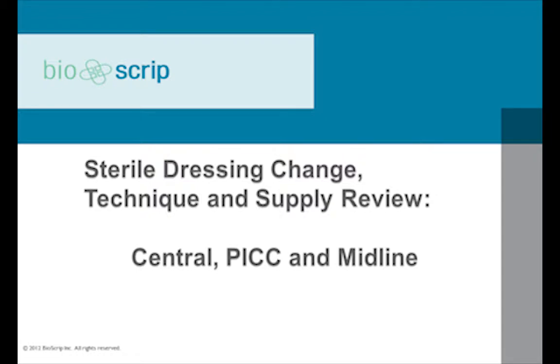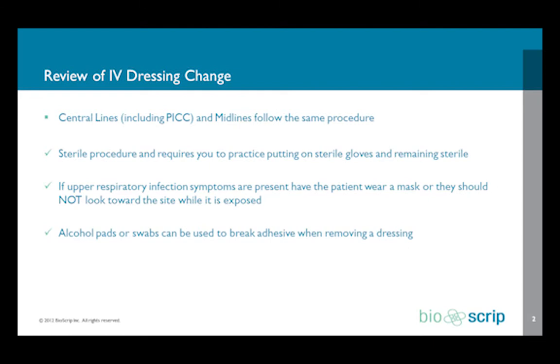Hello, and welcome to the technique and supply review for central line PICC and midline dressing change. Whenever you are doing a central line dressing change, midline or a PICC, the procedure is the same.